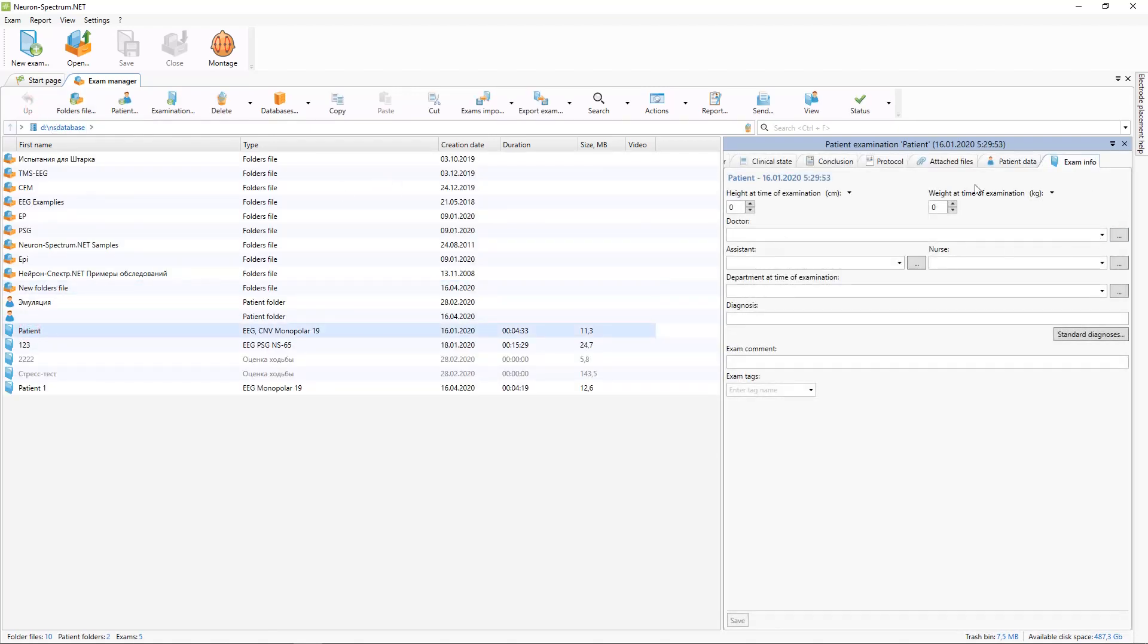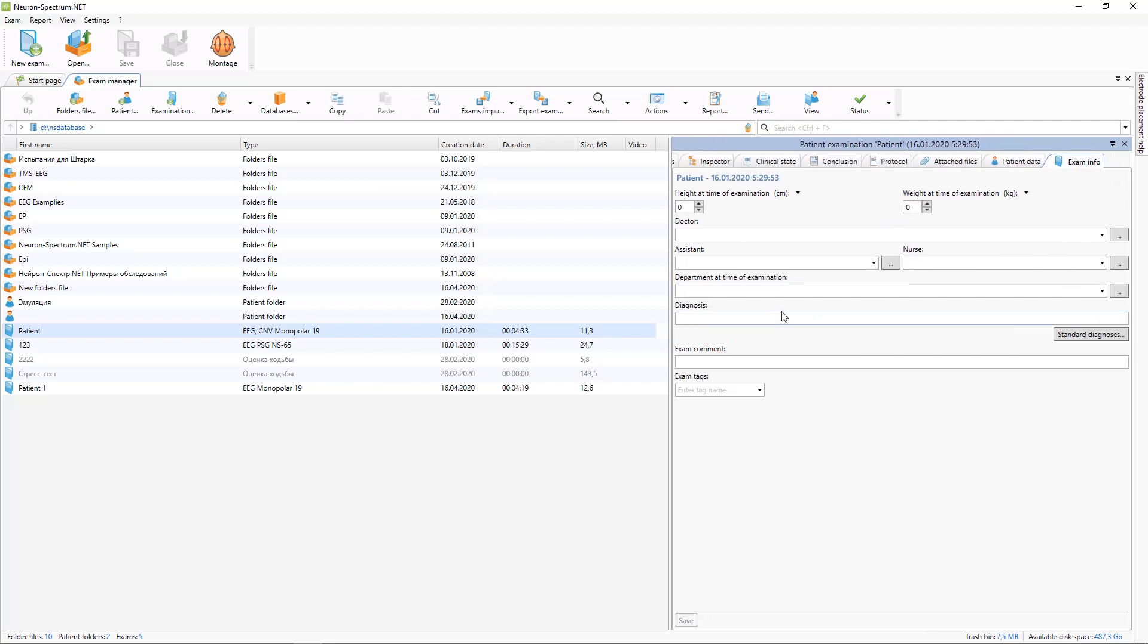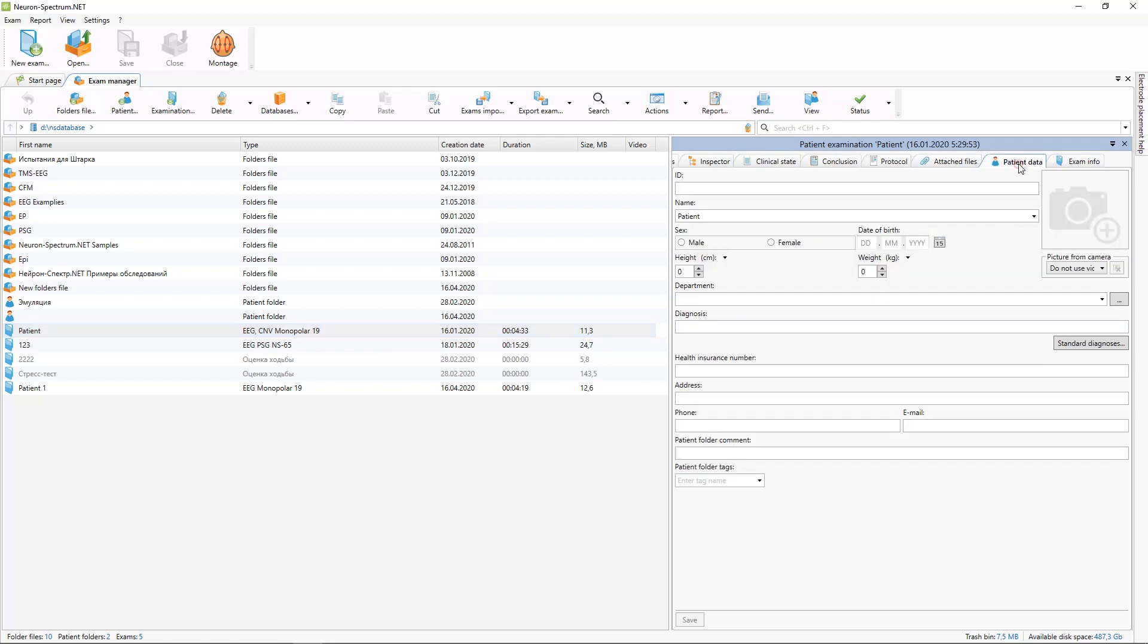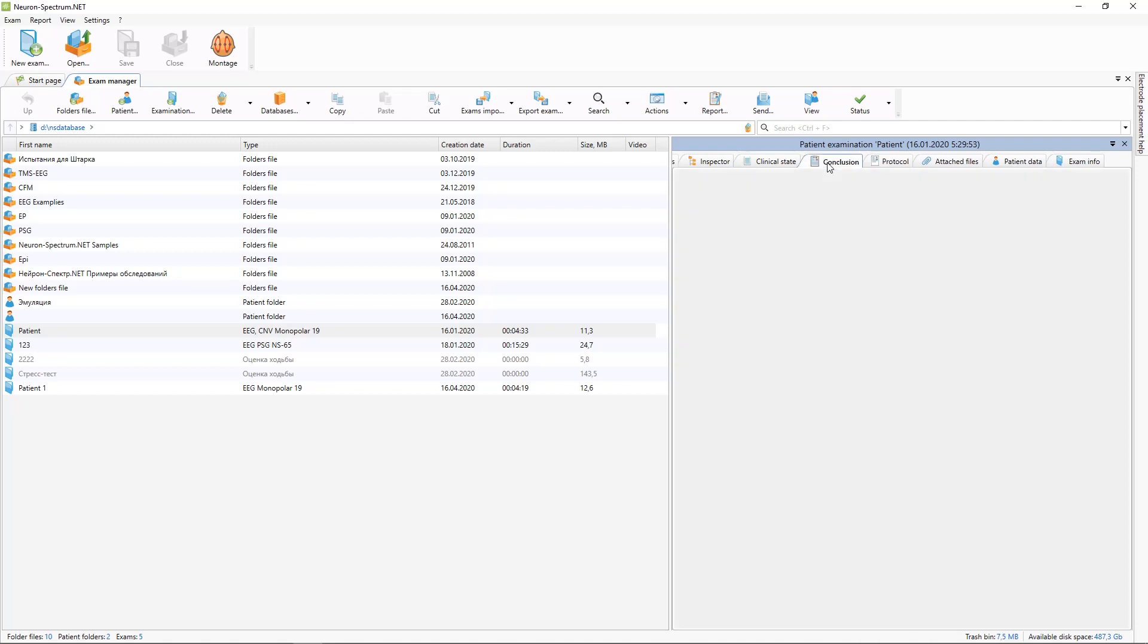On the right side of the window you can see parameters of the selected examination: some examination information, patient data. You can store attached files with each examination, report, conclusion, and clinical state in this field.